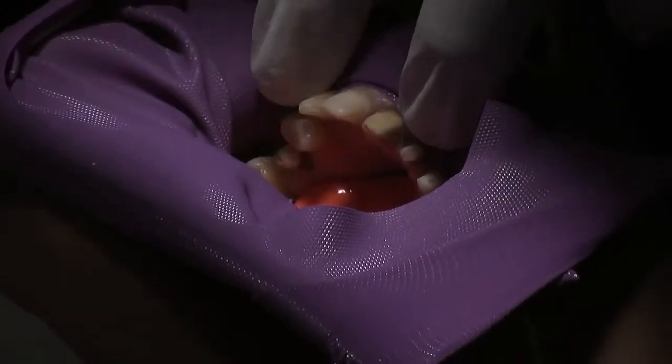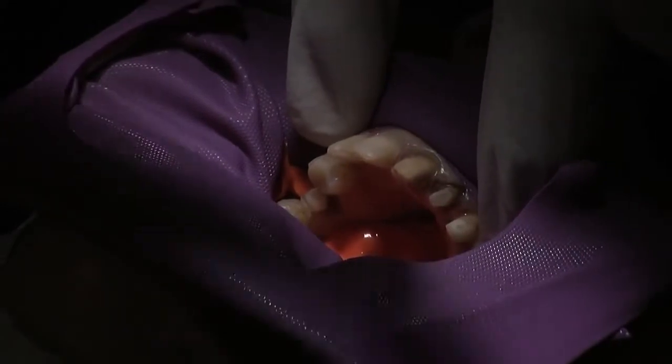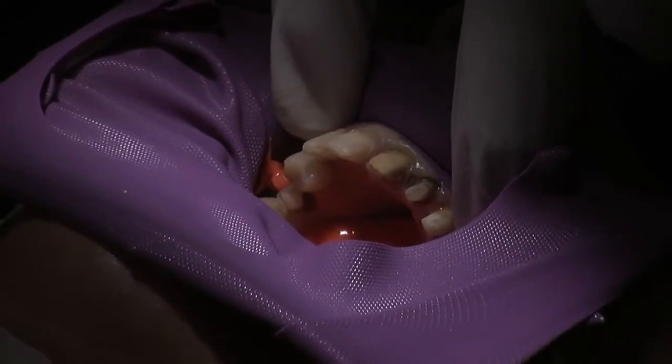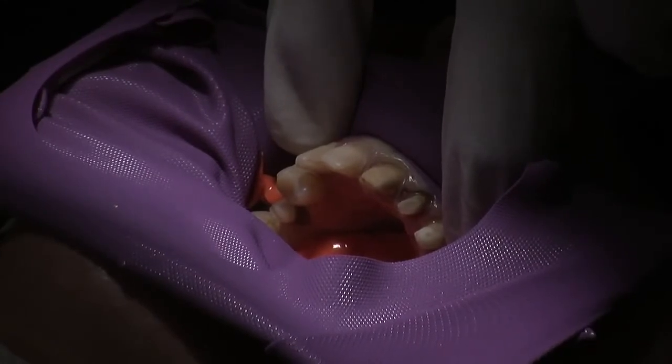The other thing I can do is just cervical to the wing here — I'm going to retract the rubber dam and I'm injecting a little bit of Obite just on the gingival aspect of the molar clamp. And now I'm pulling, retracting the rubber dam back at the front whilst that's hard. And once it's set, it'll stay in the upper position, which makes cementation much easier.